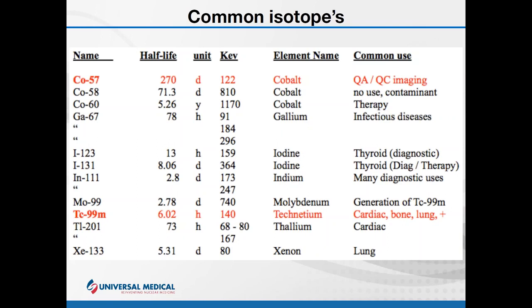It will be provided to you as a liquid in a sealed vial. So they'll take a vacuumed vial, and they'll put technetium in it as a liquid. Now, one thing to note, you must be careful. You have to take care when you're handling that vial, because it is possible for whoever put the source in the vial to contaminate the vial.